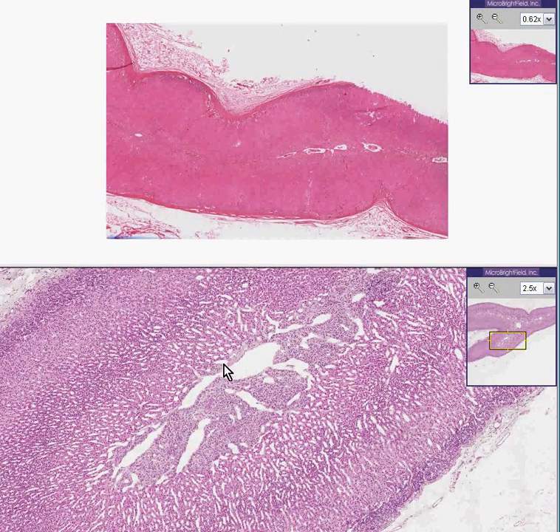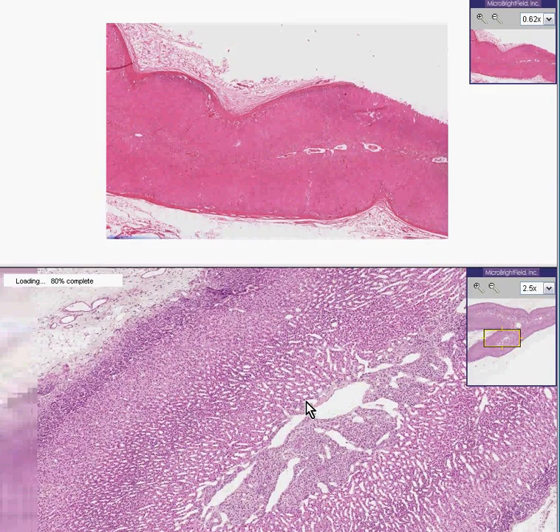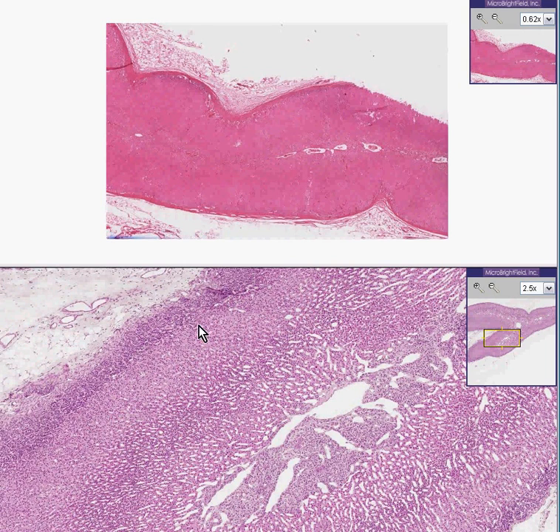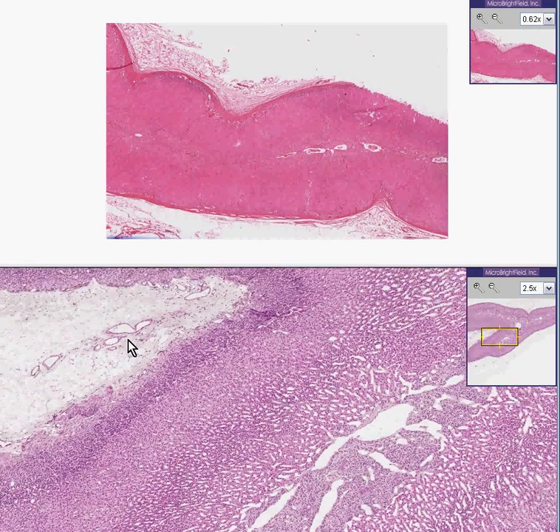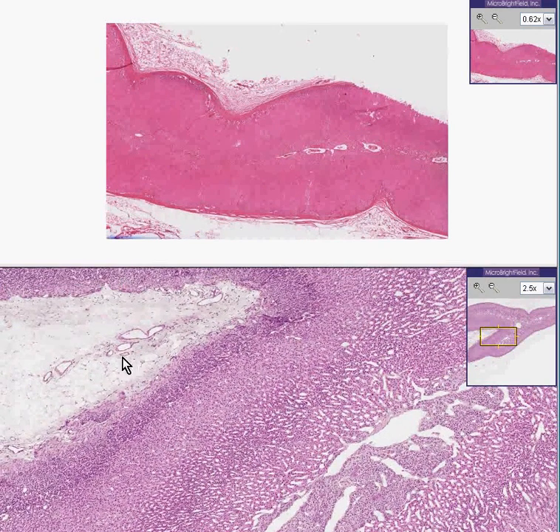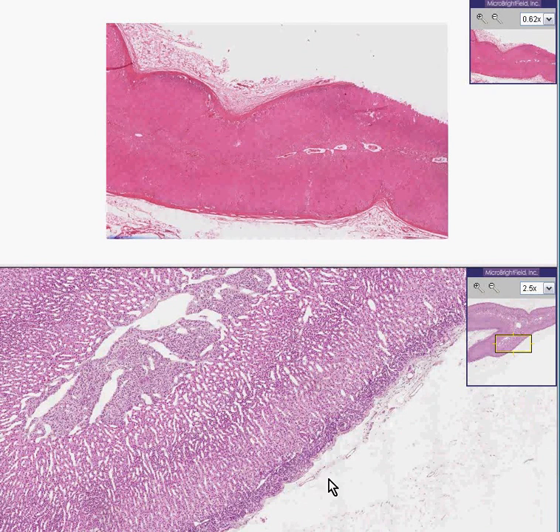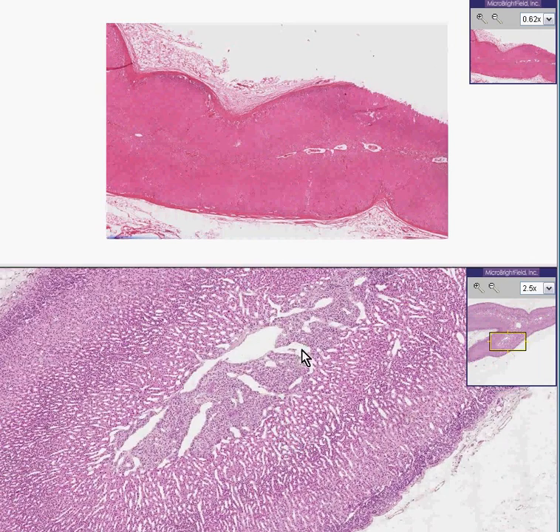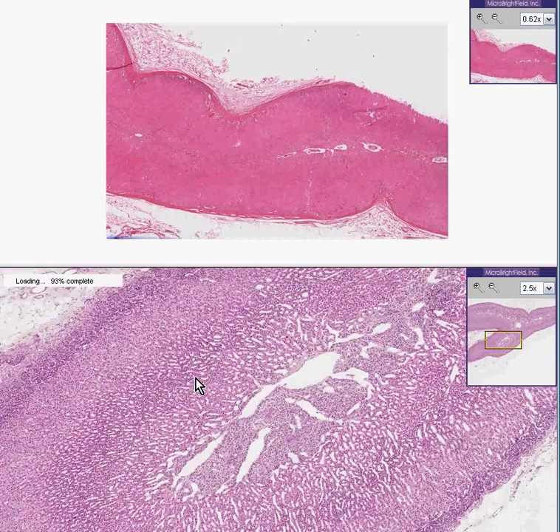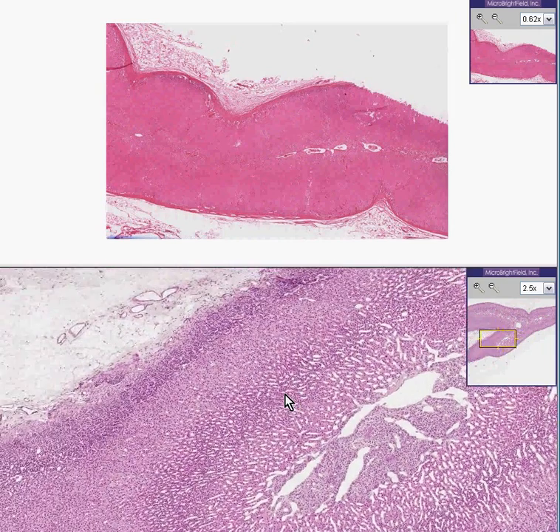Here is a structure on the bottom that is quite normal. You can recognize it as an adrenal gland. Here is fat surrounding the adrenal cortex and capsule on this side, and here in the center is the adrenal medulla.